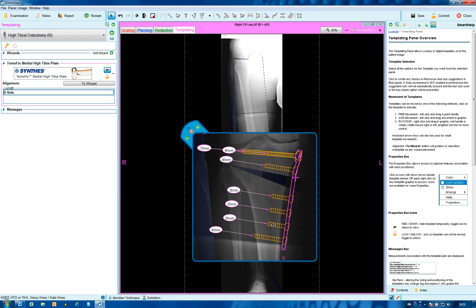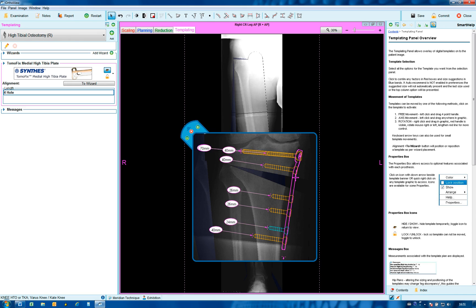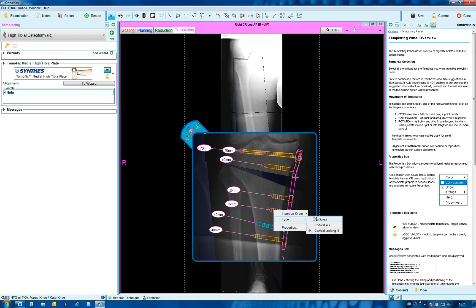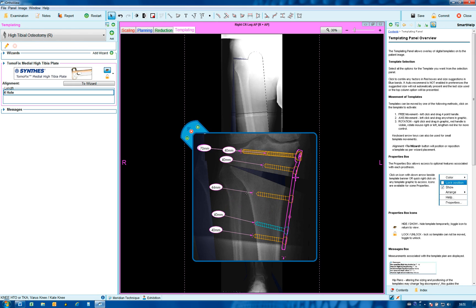Screw type can also be altered by right-clicking and obtaining the properties box — move from locking to non-locking and adjustments can be made. It is also possible to remove screws, although it might not be appropriate for this procedure where multiple screws are shown overlapping.